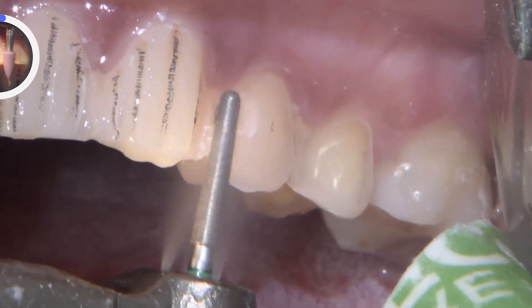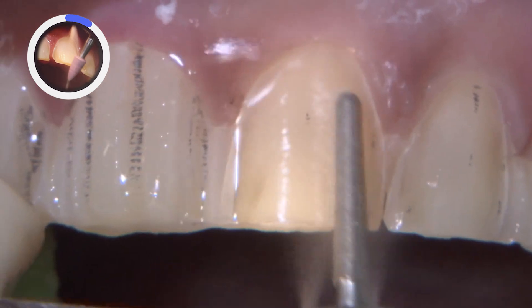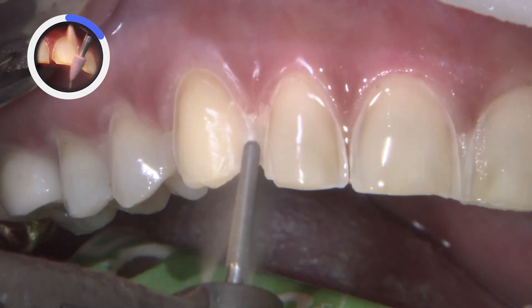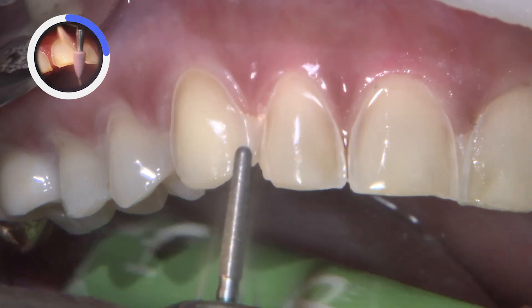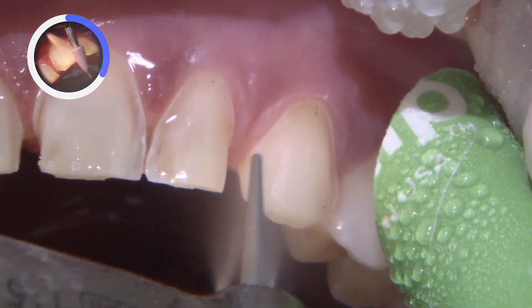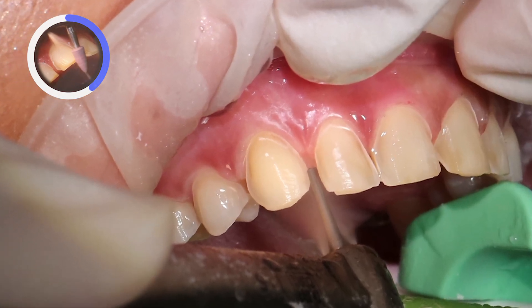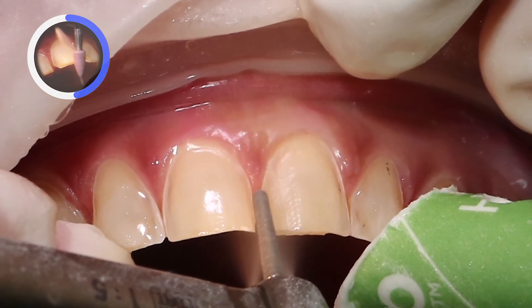Anytime we lengthen teeth with veneers, a flat incisal edge preparation is preferred for ease of fabrication, smooth path of insertion, and great adaptability of the restorations to the preparations. The incisal edges have a slight angulation from lingual to facial. For the teeth adjacent to the diastomata, the preps must be extended farther interproximately to allow room for the final restorations to create the desired emergence profiles and contacts.